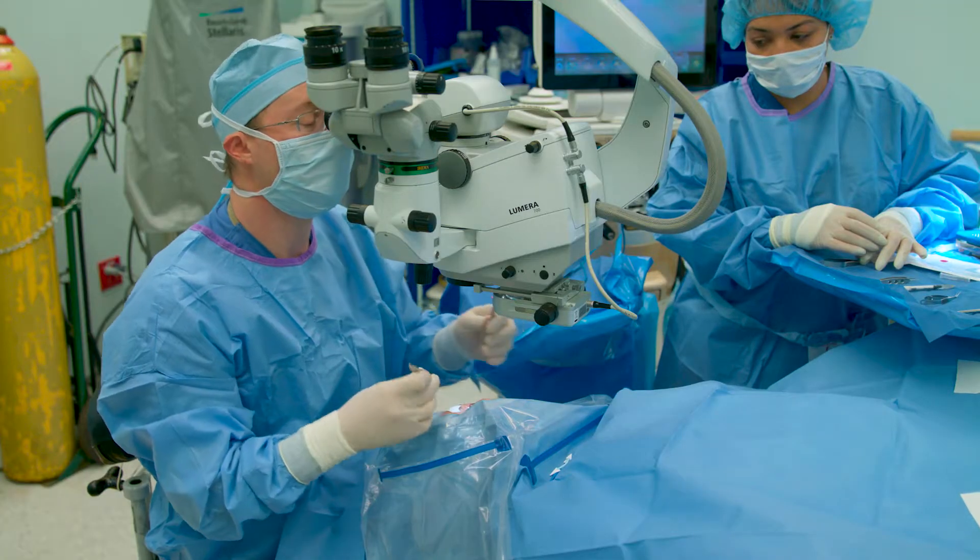The beauty of the BioD Optics graft is that it almost just adheres spontaneously, even without the need for placing the glue — and that's why it's fantastic. I find that the less pulling, touching, cutting, and every move done in a meticulous and meaningful manner, you're going to decrease the likelihood of scarring postoperatively and you'll get a nice clean result.